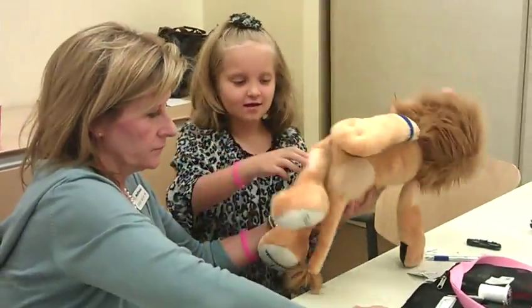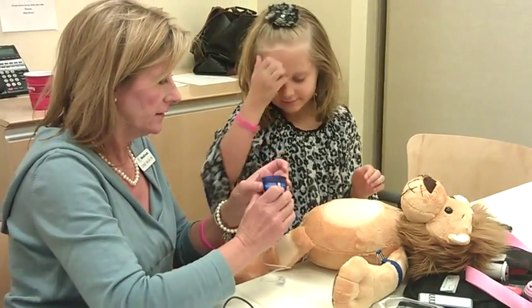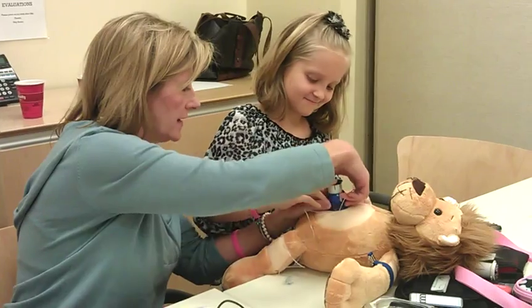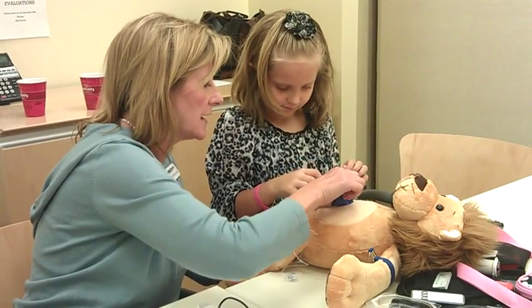So I think he should have it. You want it on his booty or his tummy? Tummy. Okay, so what we're going to do is we're going to flip it over. Is that okay? Now what you're going to do — see these two little white buttons like your mommy does? Let's turn it down so there's two things over to the side.